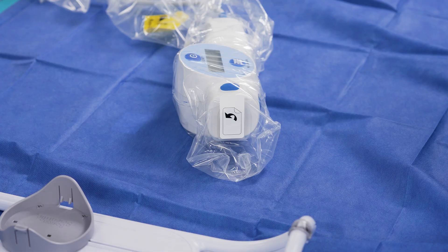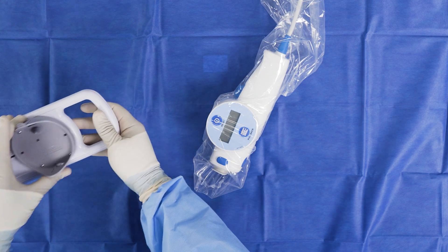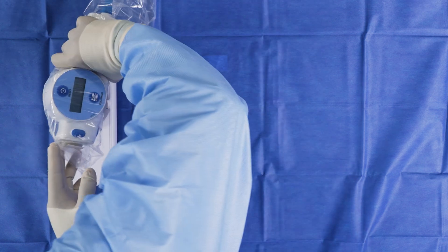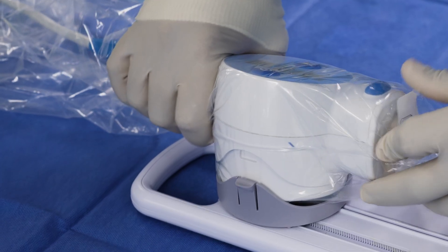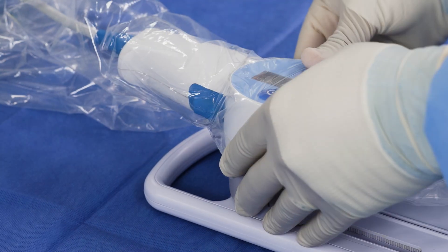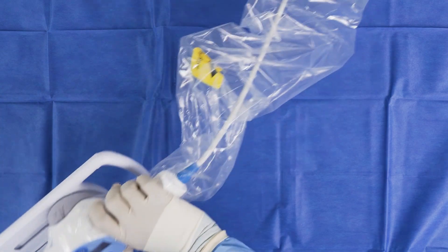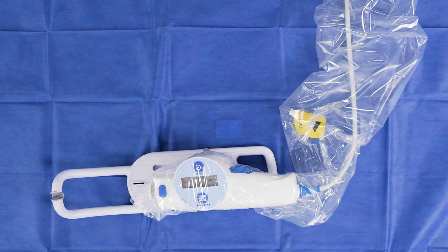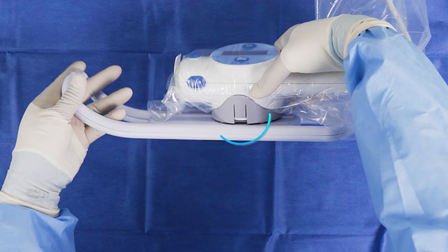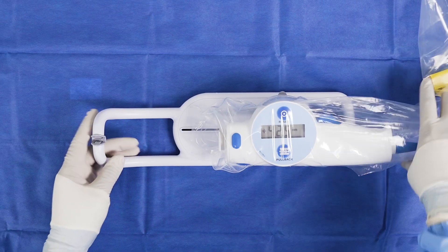Once the sterile bag is in place, attach the MDU to the disposable sled. This should be done prior to the use of the Opticross catheter. Tilt the MDU towards the bottom latch side of the sled and press the MDU down firmly against the bottom of the cup to engage it into the bottom latch. Ensure there is no material trapped in between. Verify the bottom latch is flush with the MDU cup, and ensure the MDU engages into the sled cup and pierces the sterile bag.